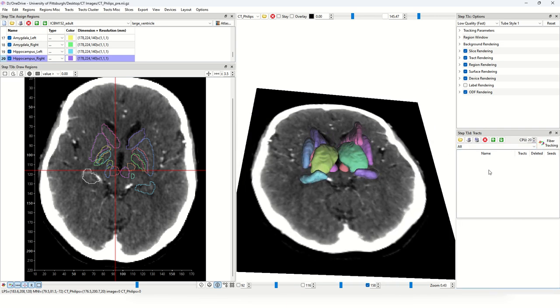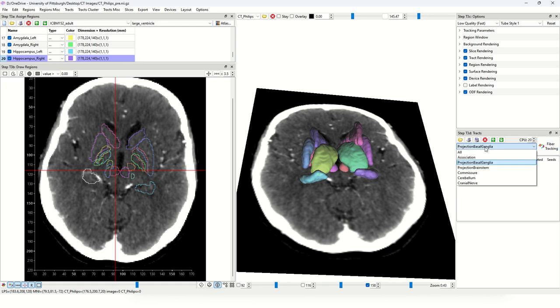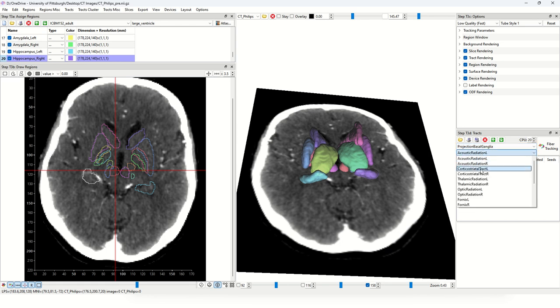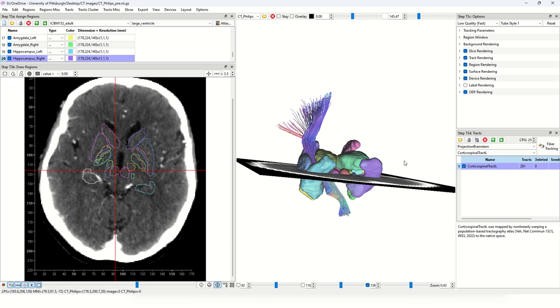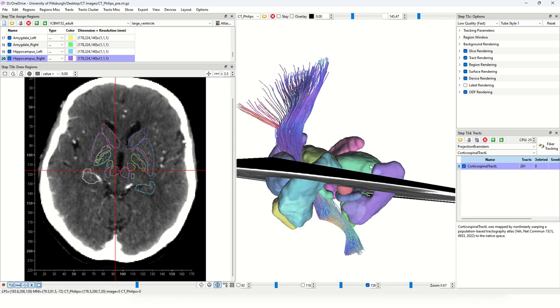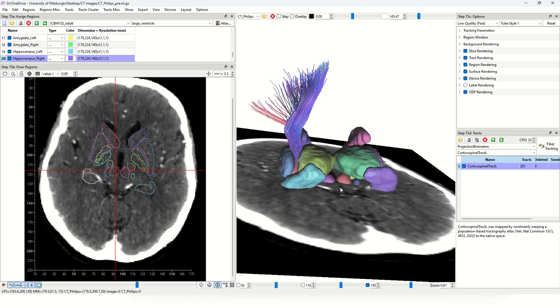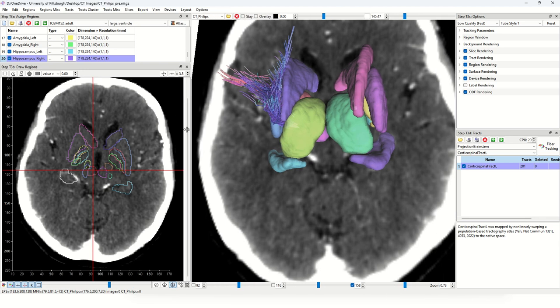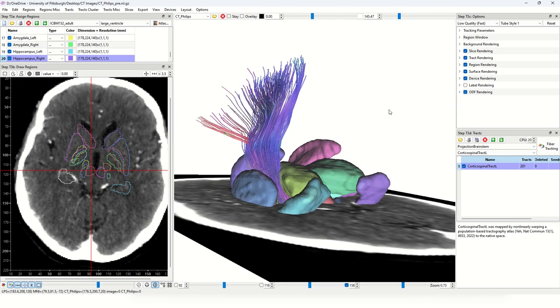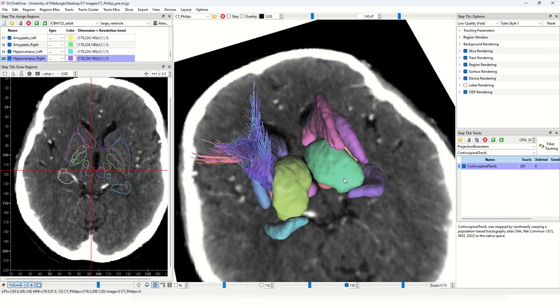DSS Studio also has built-in tracts. Once registration is complete, the menu is enabled allowing you to bring in key tracts like corticospinal tracts — click on it to bring in the corticospinal tract aligned with the subject, allowing you to study the relative location. That covers the steps for CT spatial normalization. If you have questions feel free to email me. Thank you very much for watching.